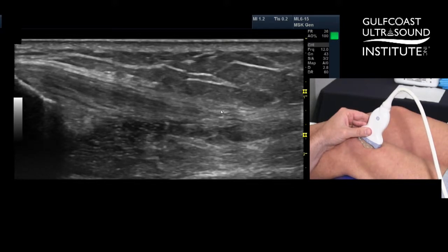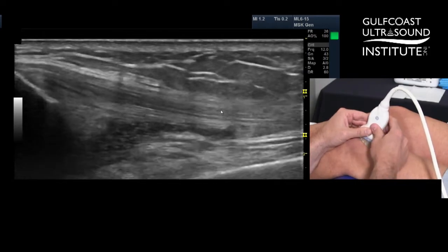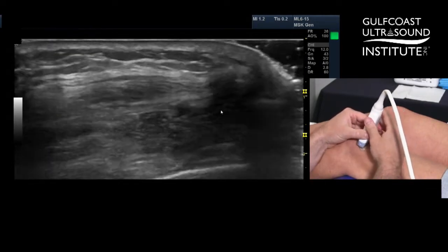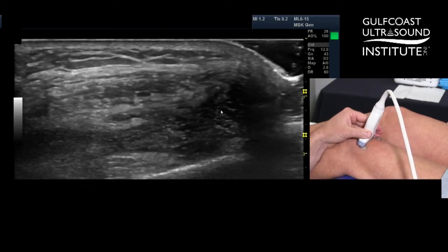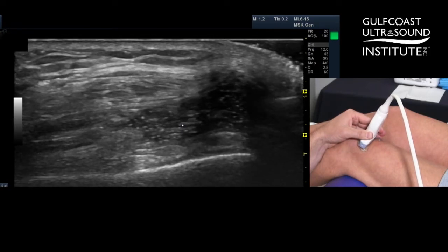This is an effusion. Lori is missing her ACL — she already had one ACL repair, then ruptured the graft. So what we're going to do is just aspirate this and put a steroid in it. We're dealing with tight circumstances here: three weeks ago we did PRP on this knee. We're doing this now because Lori has a trip of a lifetime tomorrow to New Zealand, so we're going to try to make that as comfortable as possible.